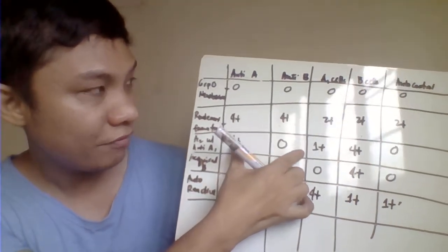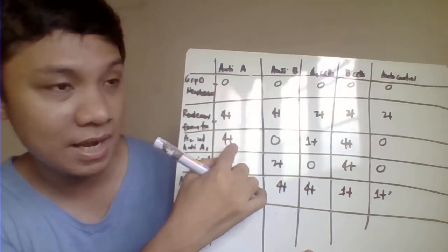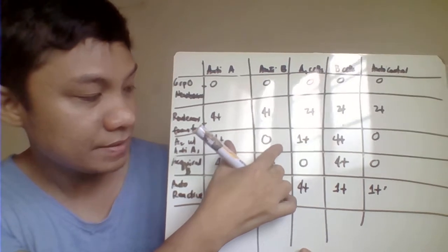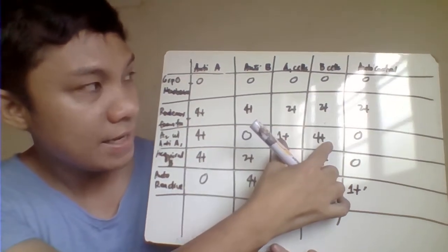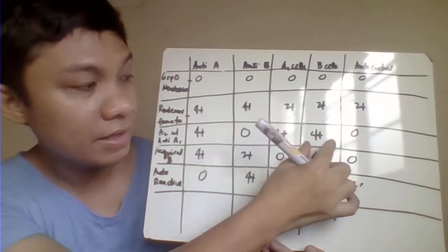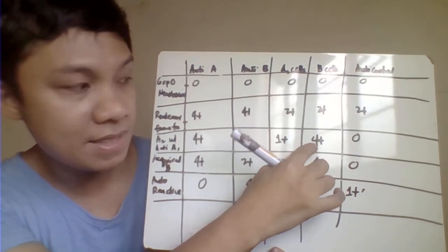Next, we have your A2 with anti-A1. So, forward typing, signifying this one is type A, kasi positive siya dito sa ating anti-A, kasi may A antigen. And notice here sa kanyang reverse typing, dapat pag type A ka, this will give a positive result for your B cells because this will detect anti-B antibody.